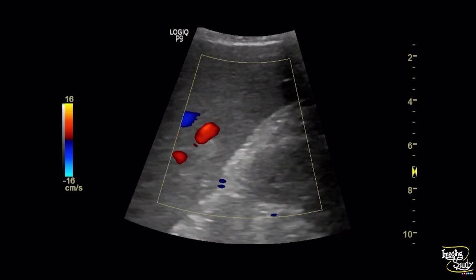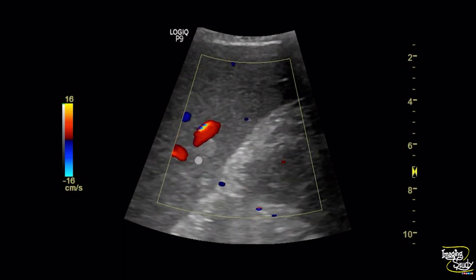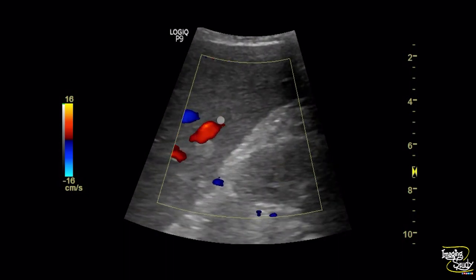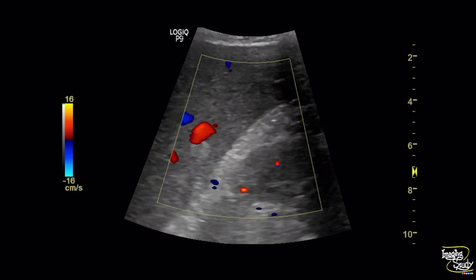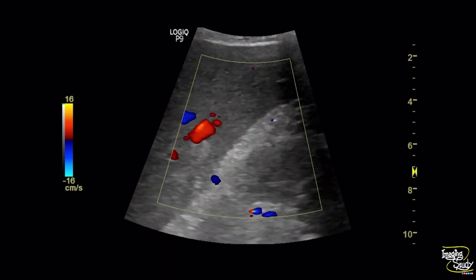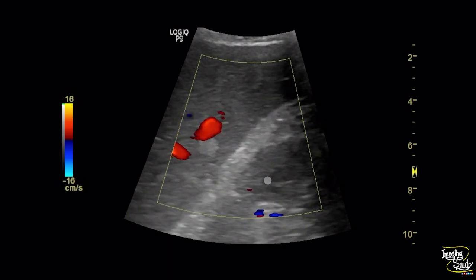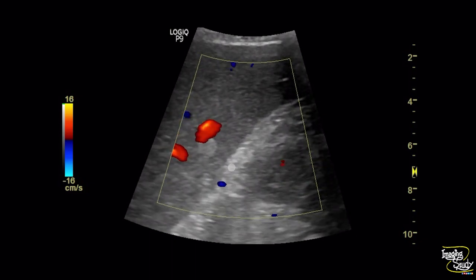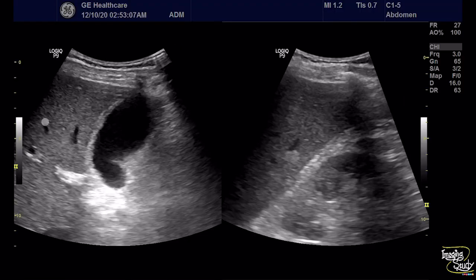On color Doppler the lesion is not disturbing adjacent vasculature, indicating the possibility of malignancy is quite low. This tiny structure getting supply from an adjacent blood vessel is possibly a hemangioma. So on the left side you can see the gallbladder with the thickened edematous wall, and on the right side the hyperechoic hemangioma.